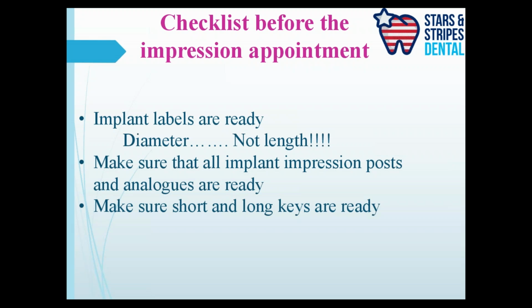Now, you need to have your implant diameter handy, because the components that will fit inside the implant for impression taking will depend upon the diameter of your implant placed. Okay, so you will need various components. You will need to order those beforehand. So you have to make sure you know the diameter of the implant very, very well. I don't know if we mentioned that earlier in the surgical lecture or not. That is why we always maintain a record of which implants, which diameters, have been placed in which patients.